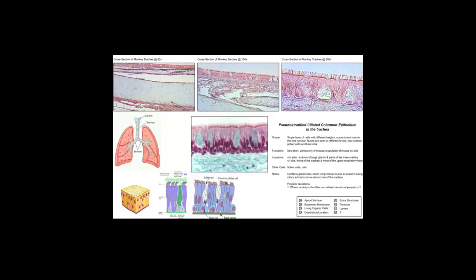You can see on the edges of the cartilage, further magnified here, when you look at this, you see chondroblasts that are differentiating, pushing as they mature, leaving that differentiated new chondroblast in its place, and then maturing and moving to the center in its lacunae in a rigid matrix that contains GAGs, chondroitin sulfate, hyaluronic acid, and water as the matrix that's hardened and resilient to any stress or strain that's placed on it.